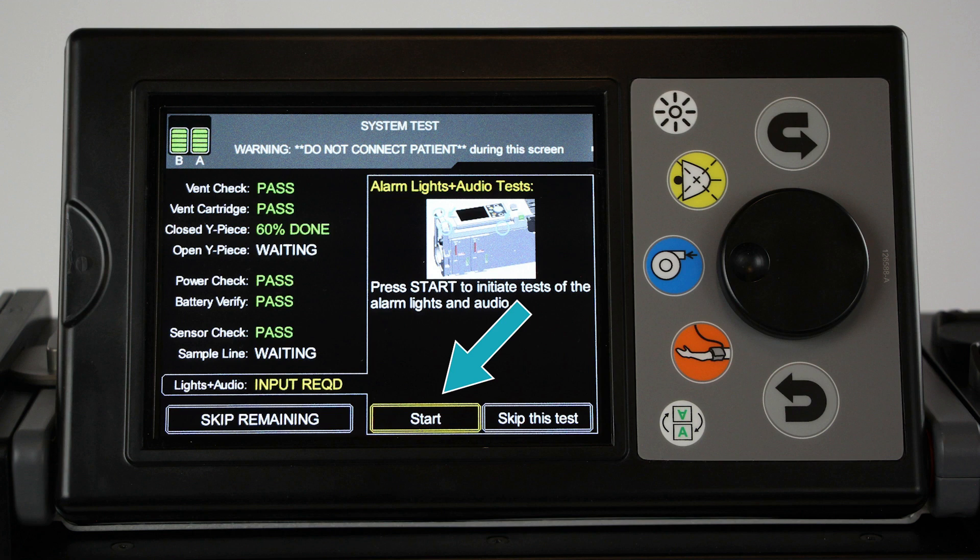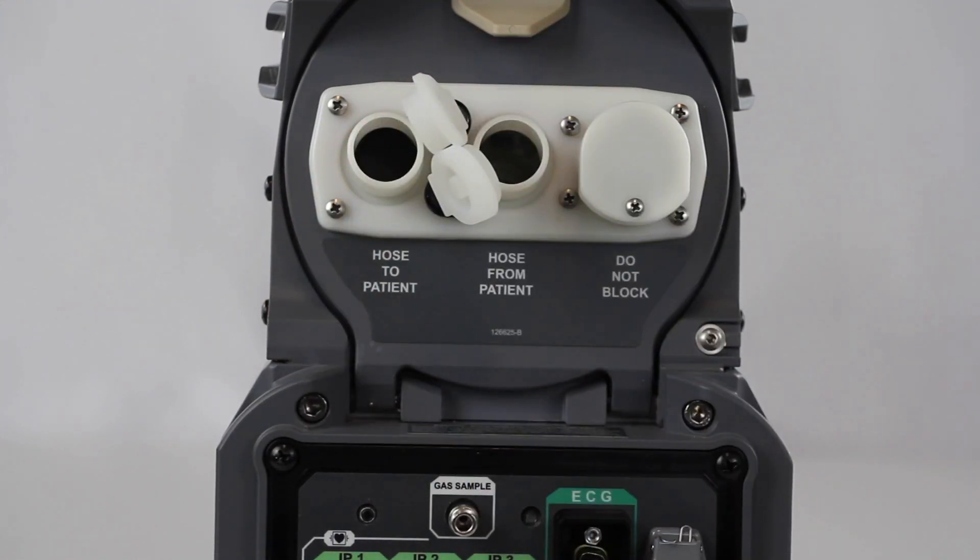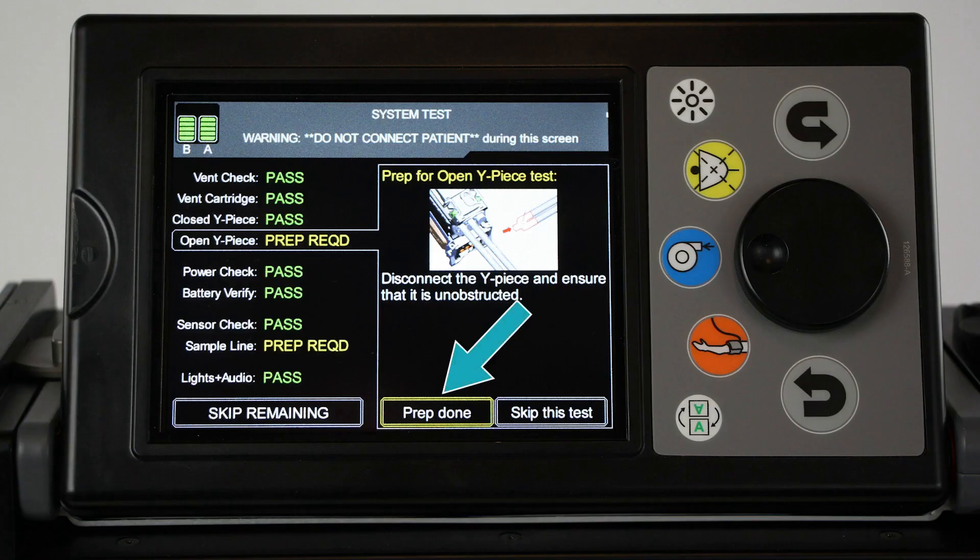To initiate the alarm lights plus audio tests, select Start, then observe the device in order to answer yes or no to the displayed questions. To complete the open Y-piece test, ensure that the ventilator port covers are open, then select Prep Done.